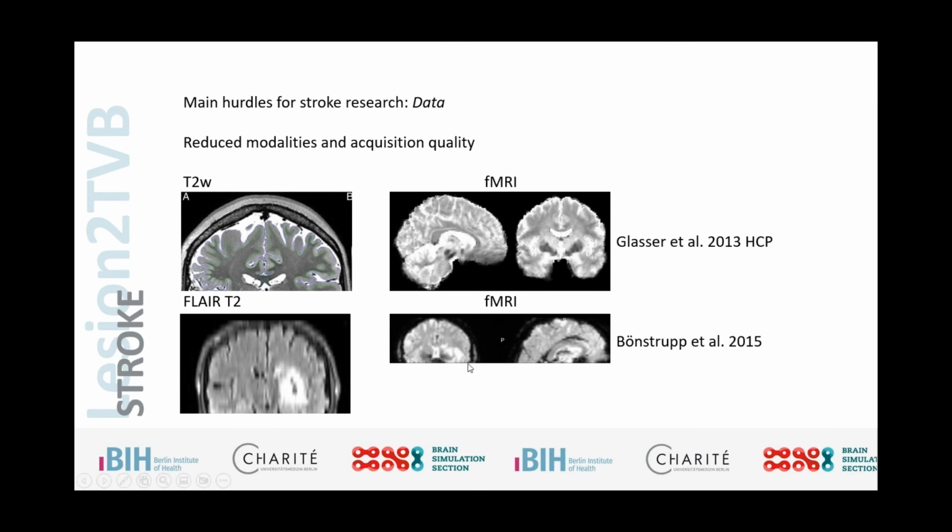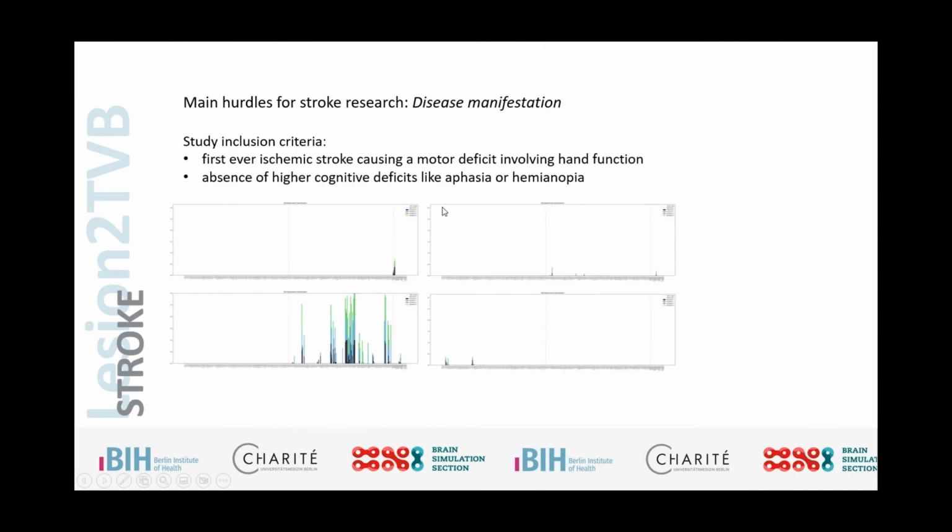So even the regions that are not affected by the lesion itself have missing data, which represents a challenge for the processing. Processing missing parts is obviously significantly different than when we have a full brain available that we can use for our processing.